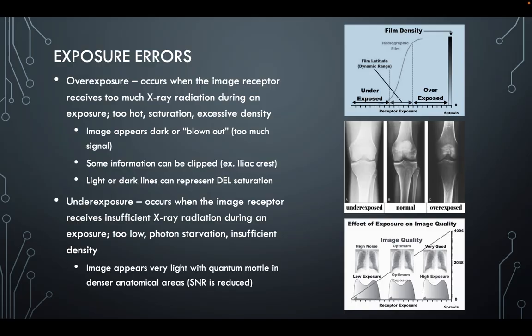So please make sure that you get those straight in your head. There is patient density that is going to show up as super bright white if they have really dense bone, if they have hardware, and then it is exposure density or excessive density to your detector that leads to overexposure. So think of it as your pixel.